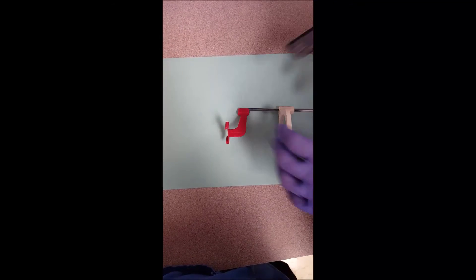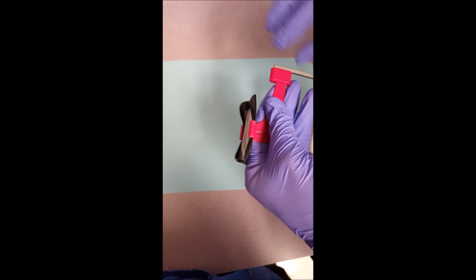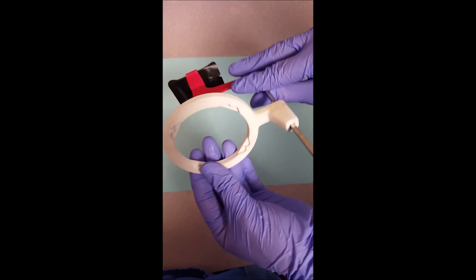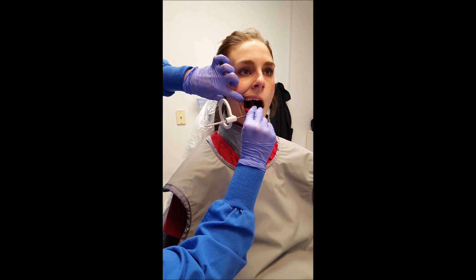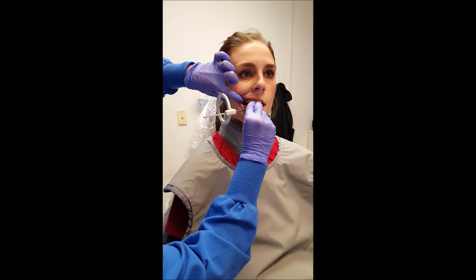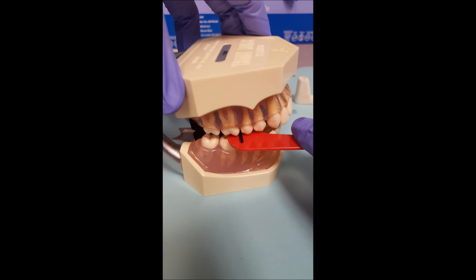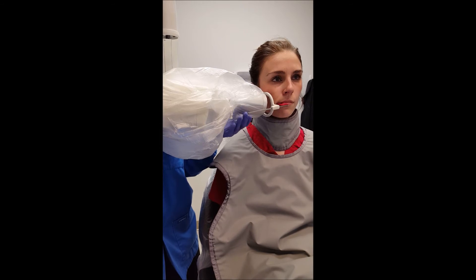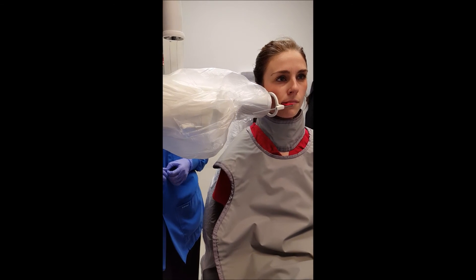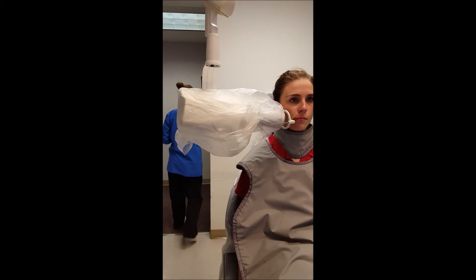Place another unexposed phosphor plate onto the XCP instrument correctly. Place the instrument with the alignment between the 2nd premolar and the 1st molar. Position the correct angulation of the PID for exposure and adjust the KV to the correct settings. Instruct the patient to hold still, leave the room, and expose the patient.